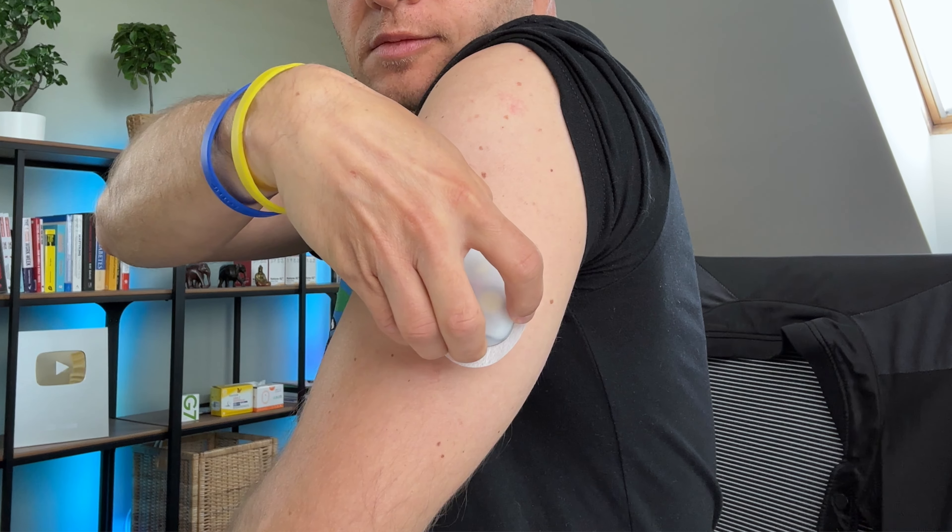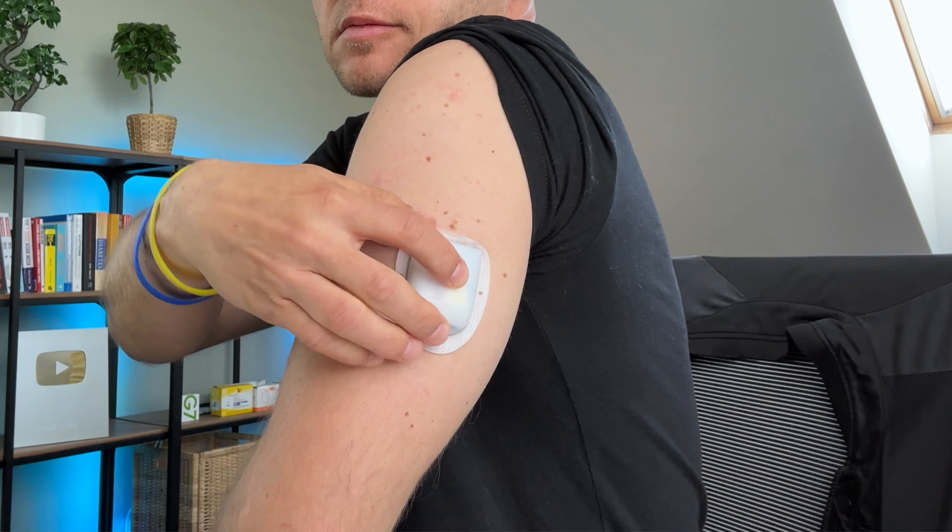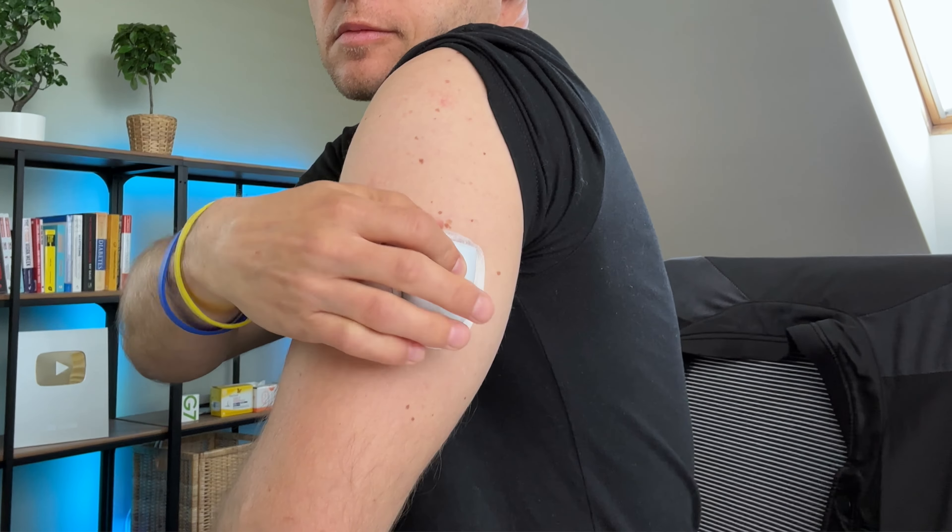Now I need to get rid of all the air bubbles. We need to stick the needle into this little hole on the back side of the pod, right where the big arrow is pointing, and push the insulin in. This is the first time I'm doing this with an Omnipod and you can see my hands are shaking a bit. It seems I did it right — I could hear the two beeps, which is always a good sign.